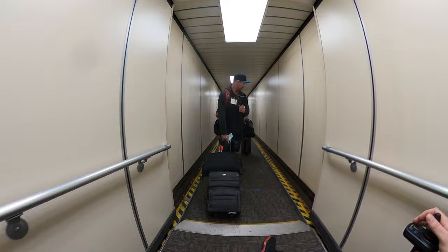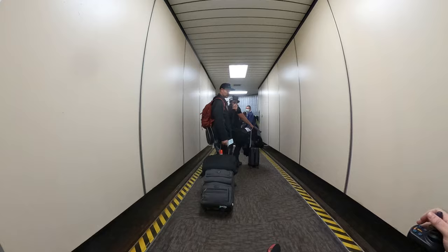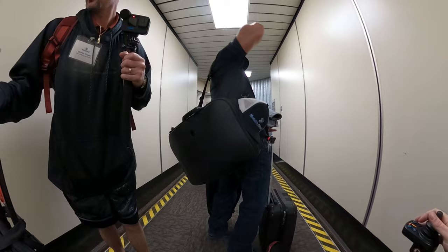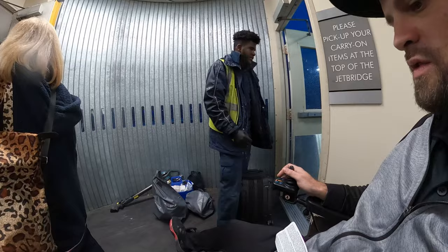Scooter here. I have to take out the battery and take out the controller. At this point, I can elect to have assistance getting on the plane, but I'm not going to. I'm going to walk on. So once I get up here, I'm going to do a little disassembly, fold the power wheelchair and disconnect. Before I get on the plane, can you do me a favor? Take off my laptop bag for me. All right, at this point, I'm going to get out of here and disconnect.